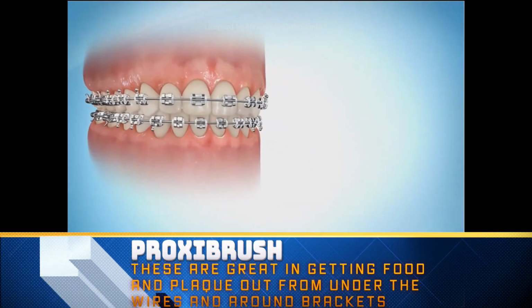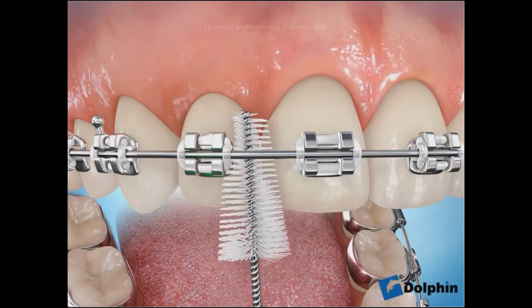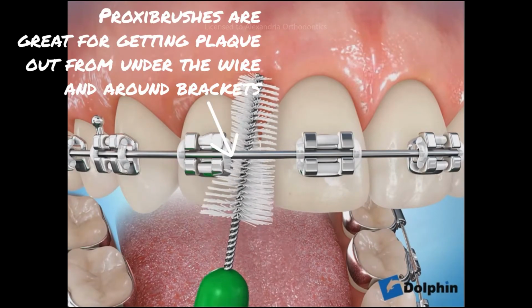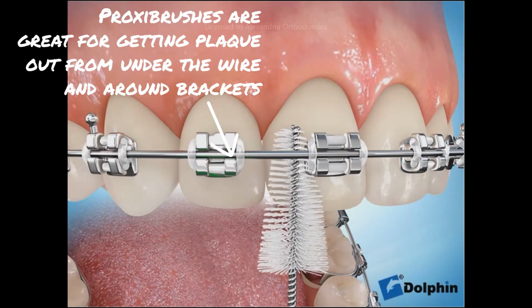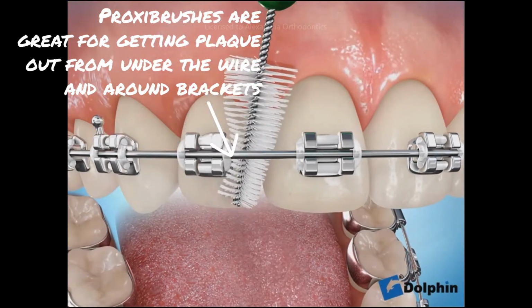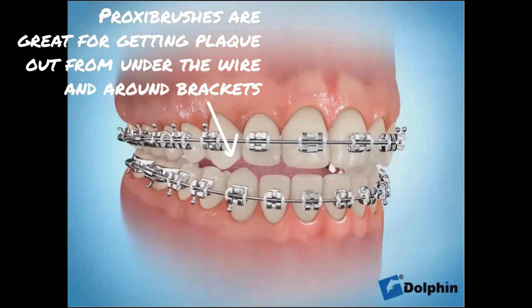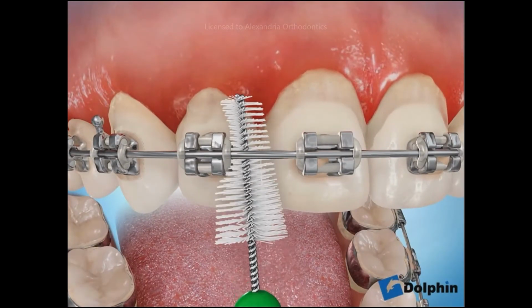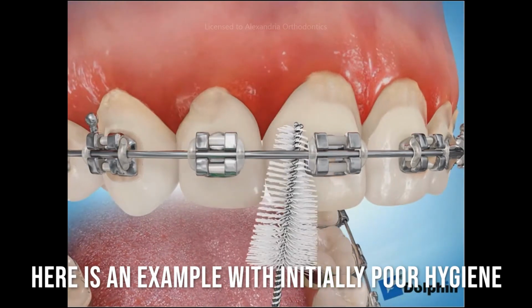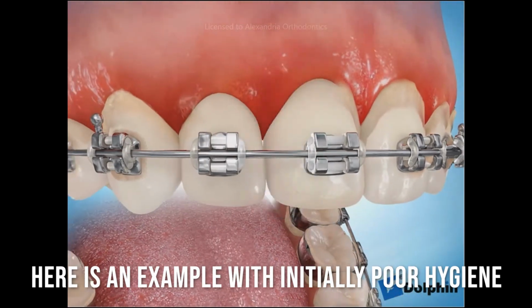The proxibrush is in your oral hygiene bag. It is often called the skinny brush or the Christmas tree brush. They are often portable and reusable with a cap. They are very useful removing plaque under the wire, between the teeth, and cleaning around the brackets. Sometimes areas of irritation in the gums may indicate that you are missing an area. Use the proxibrush to clean around these areas. As with many irritations, you may see some blood. As you keep the area clean, the bleeding should go away.